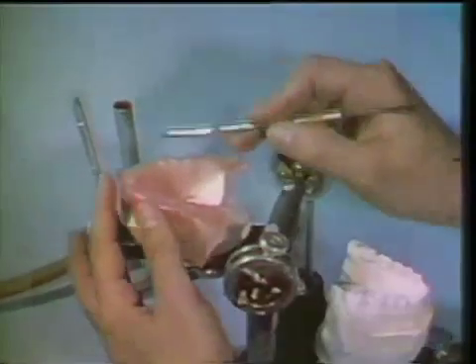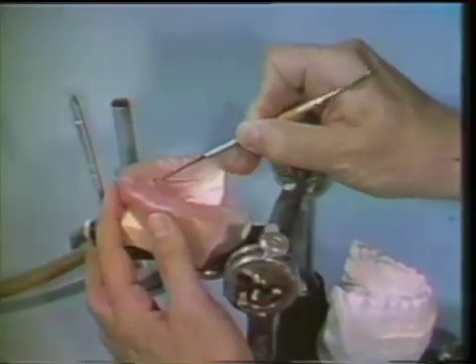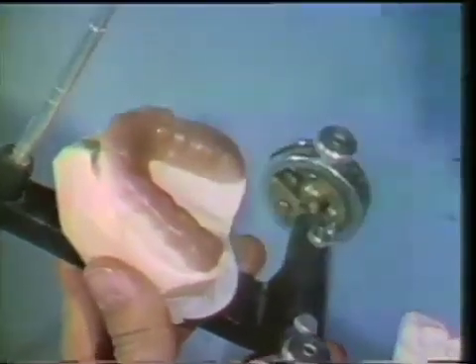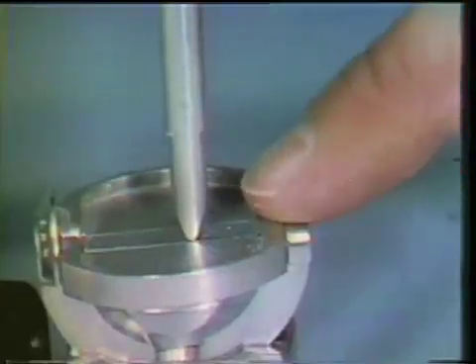The excess wax is trimmed with a hot wax spatula. The wax in the palate is carved to a U-shape, allowing enough thickness to provide sufficient strength in the bite plane. The wax is removed from the buccal surfaces of the teeth. The occlusal surface of the wax is re-softened. The articulator is closed as far as the incisal pin will allow. The incisal pin must make contact with the incisal table of the articulator to ensure the desired vertical dimension of the bite plane.